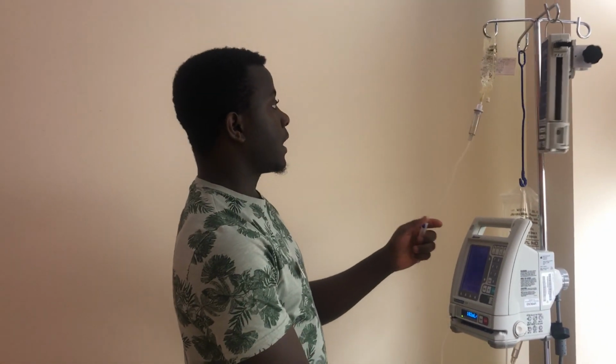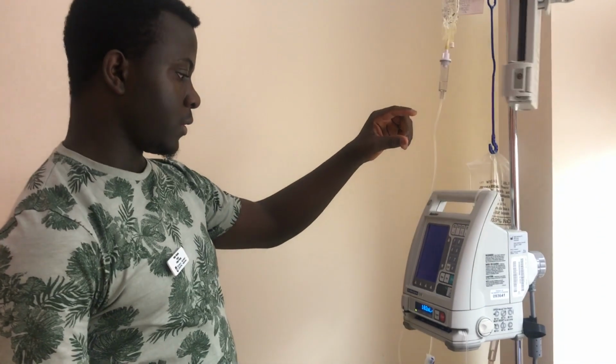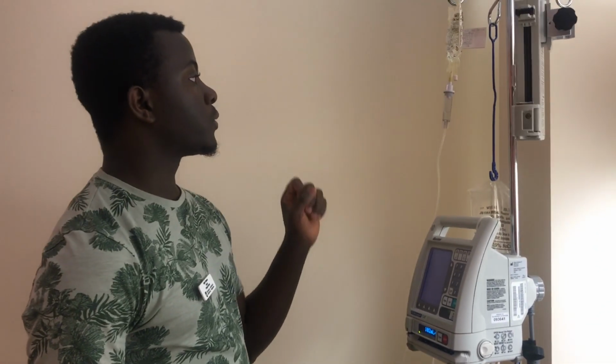After I confirm, I'm just going to let you know that the side effects are nausea and vomiting and pain at the site. And after I confirm my secondary, I will just unclamp it. So just unclamp, for you I'll make sure I watch for 3 drops to see that it's running. Now I'm actually going to proceed with this medication. I'm just watching for 3 drops.